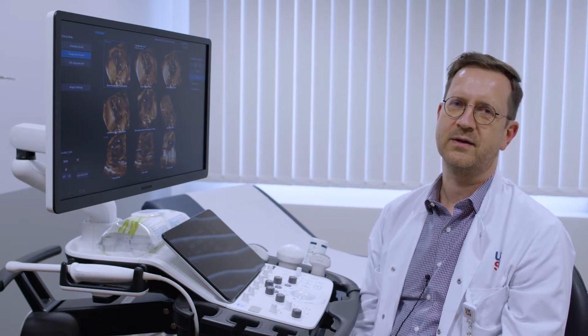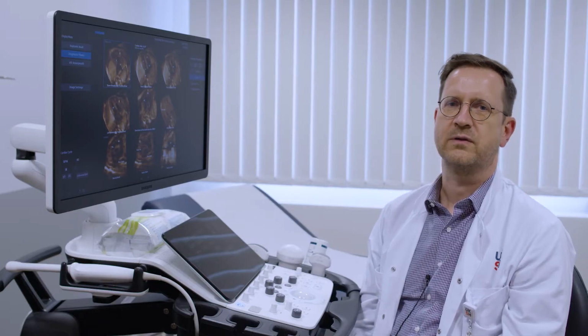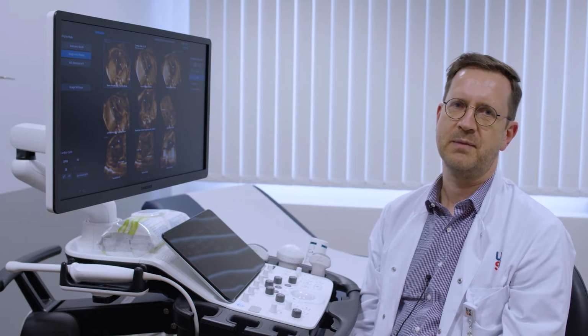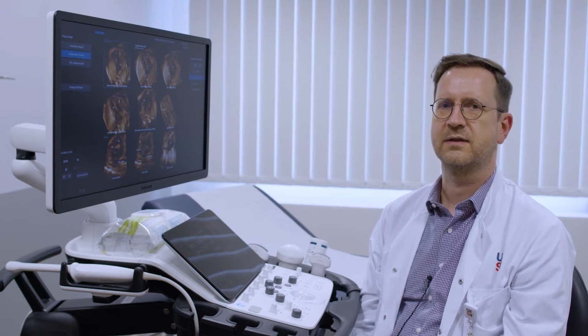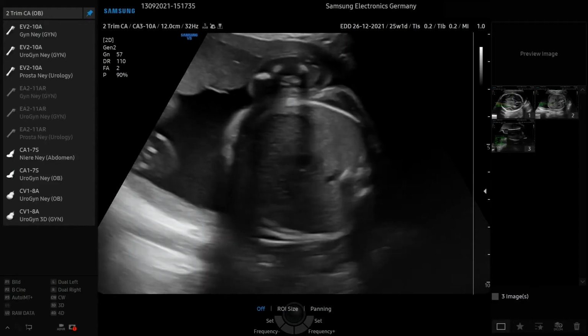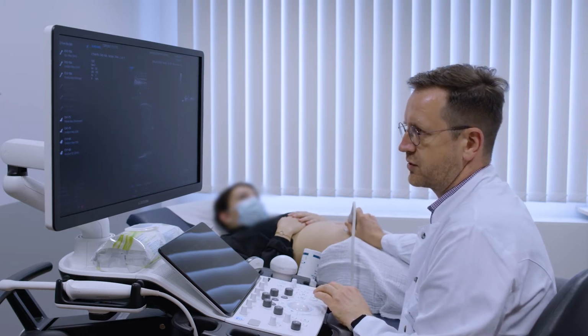What we're going to talk about today is the biometric assistance and automatic assessment of biometric parameters, and we further focus on the assessment of cardiac structures in B-mode ultrasound and in color Doppler ultrasound. Finally, we will apply a semi-automatic technique, the 5T heart technique, to automatically reconstruct cardiac structures, and this is what we're going to do today. I would like to show you the performance of the V8 machine in assessing the fetal cardiac structures.